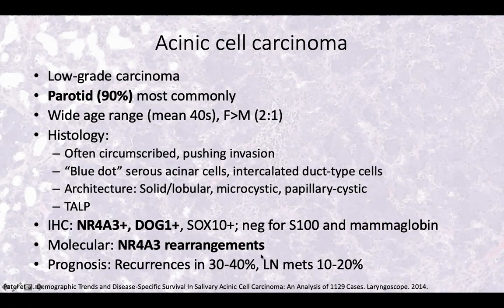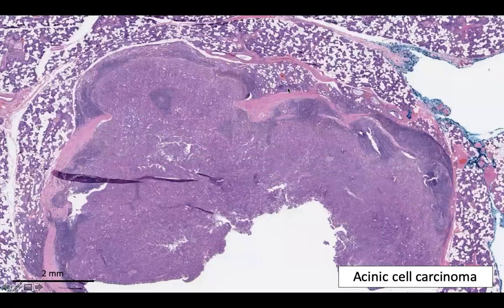Prognosis is relatively good. You can have recurrences in about a third of cases, and you can get lymph node mets in about 10 to 20%. It's pretty rare to die of this disease, but it can happen. So here's a low power image.